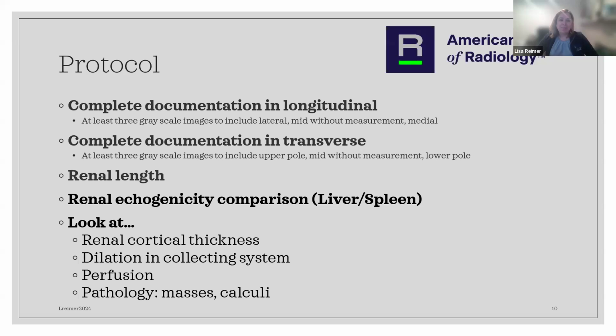It's also helpful because it keeps you on track. You can quickly get into the weeds with some of this stuff when you're scanning around. So it keeps you on task. And then in some cases, if your lab wants to be accredited or you want to bill, you will have to follow protocols. So there are three important reasons I think that protocols are helpful.